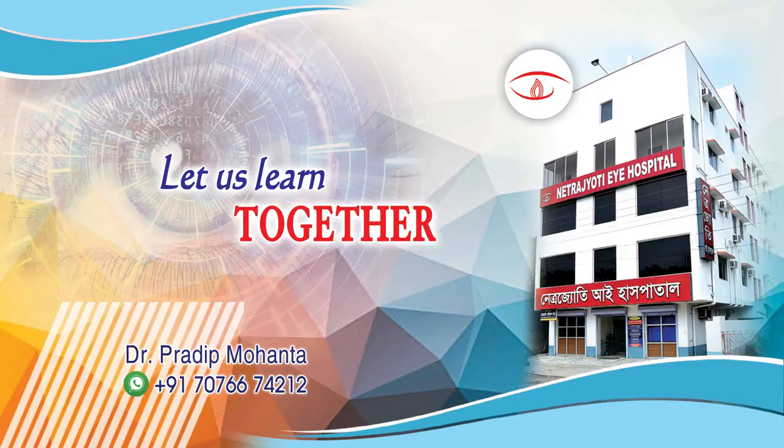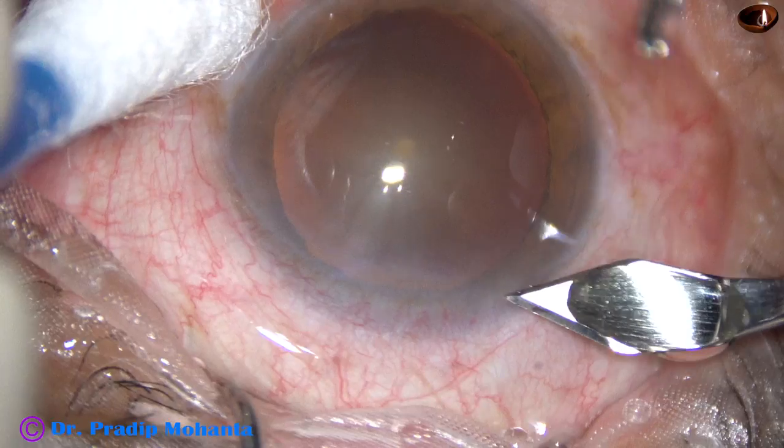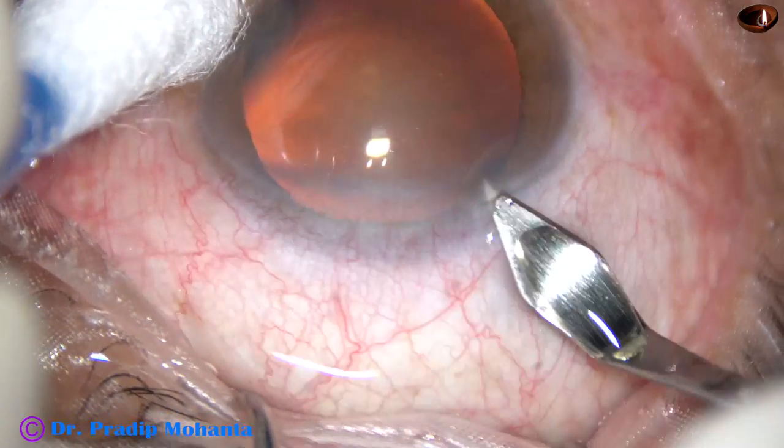Friends, welcome to my workplace at Rana Ghat, West Bengal, India. Let us observe phacoemulsification of this very soft cataract. This is a totally unedited recording.